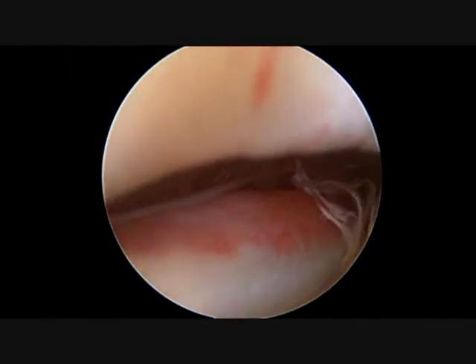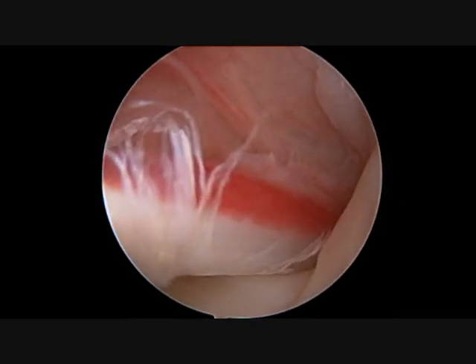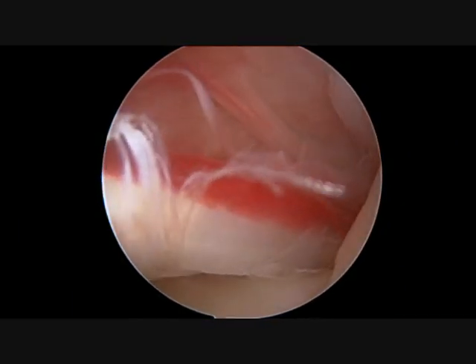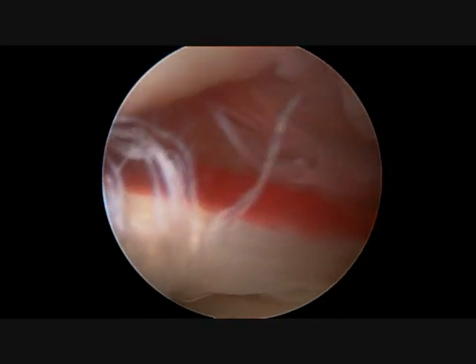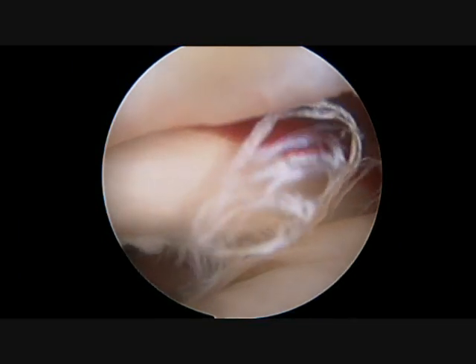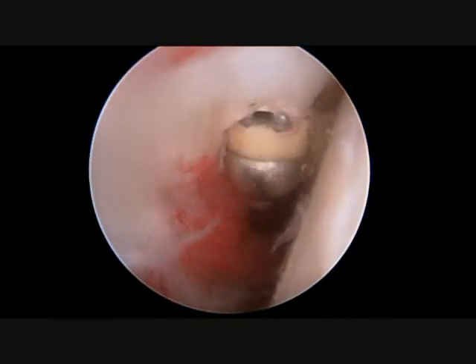The biceps tendon is then pulled into the shoulder joint so I can evaluate the size and the quality of the tendon. The arthroscope is then positioned to look in the front of the shoulder down the biceps tendon sheath. Here I can clearly see extensive tearing as well as a large amount of erythema or redness on the tendon, suggesting that this is a very diseased tendon.